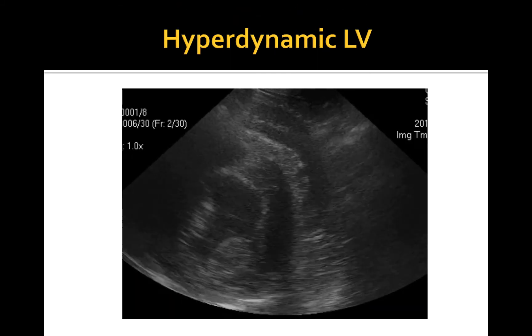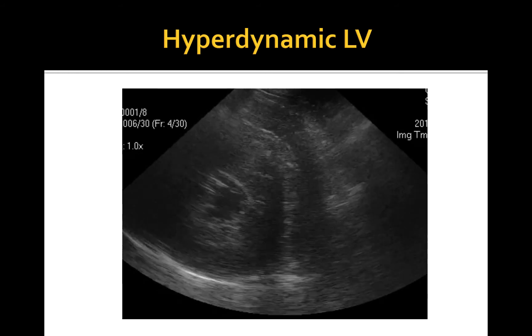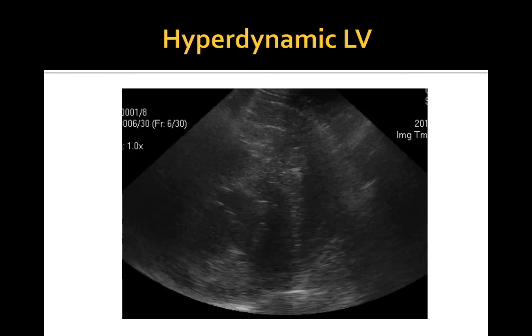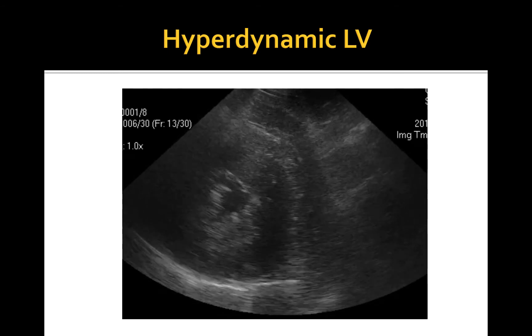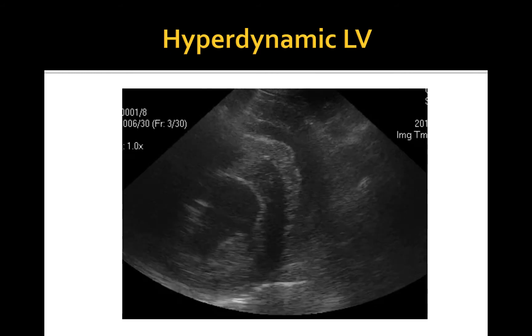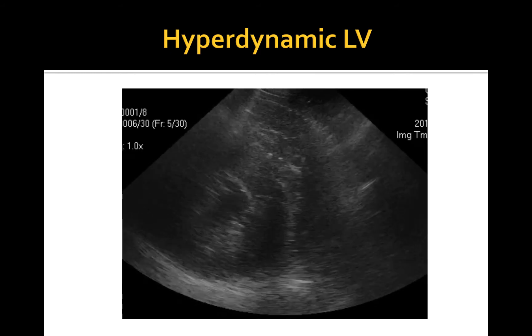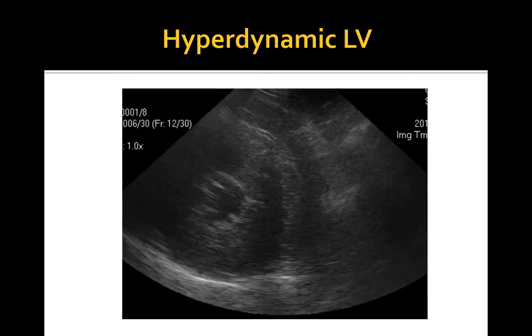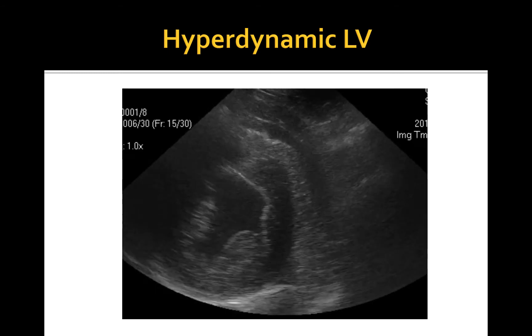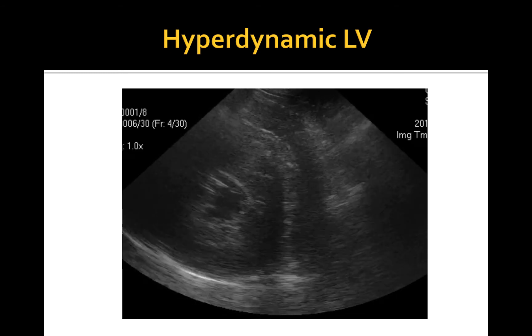This is an example of a hyperdynamic left ventricle. Here you can appreciate a small LV lumen during systole and vigorous hyperkinetic contractions obliterating the ventricle in systole. You can also appreciate the so-called kissing of the papillary muscles, which come in contact during LV contraction. Hyperdynamic LV is traditionally associated with hypovolemic shock; however, its presence doesn't always equal volume depletion in your patient.